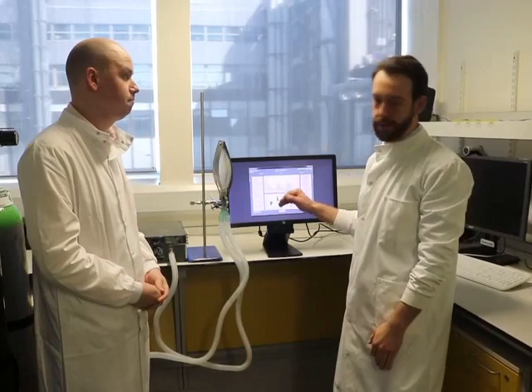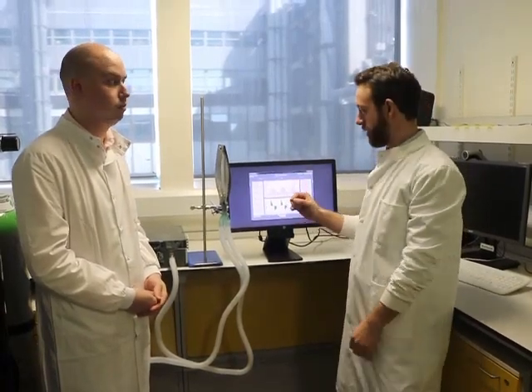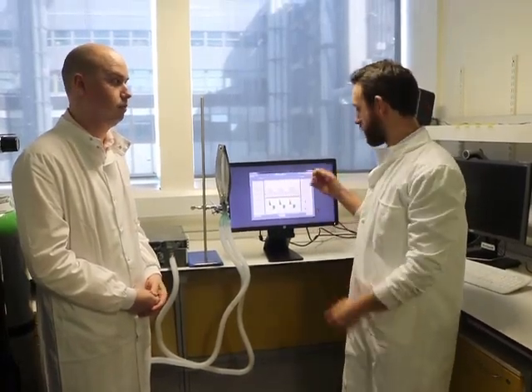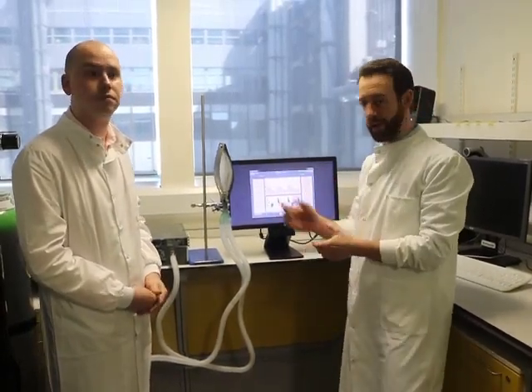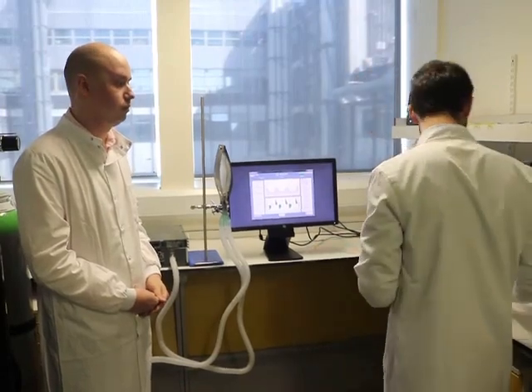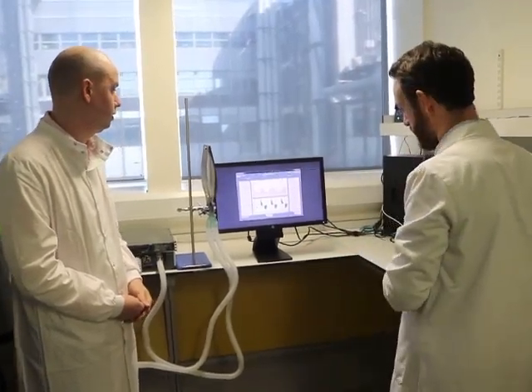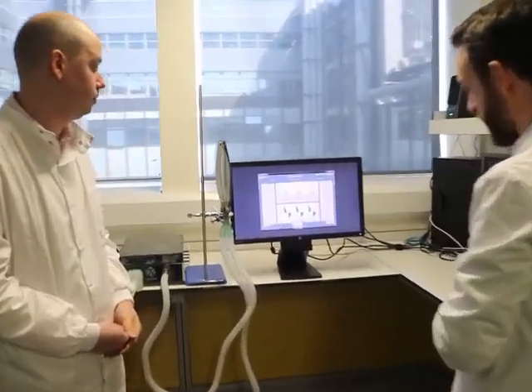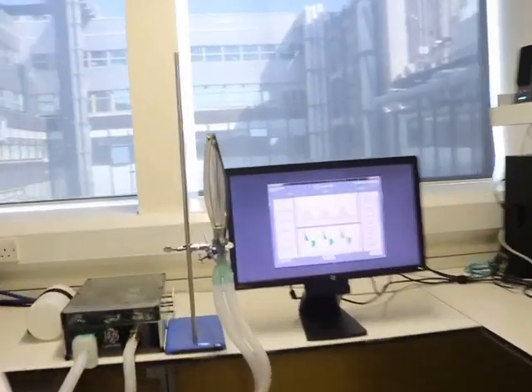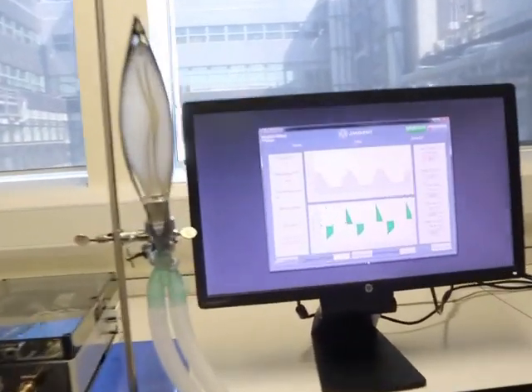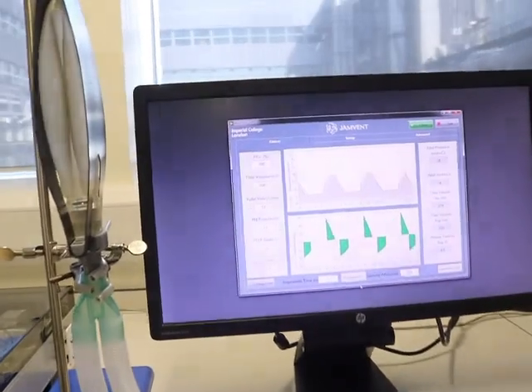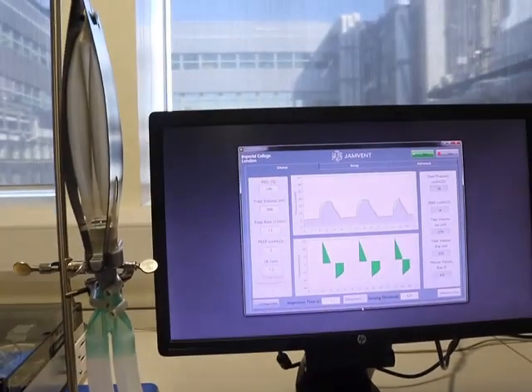Basically it senses the patient's breath. There's a small reduction in the pressure and then responds by delivering the required volume. So I'm going to move it into spontaneous mode here, and Jakob will simulate an in-breath by the patient.